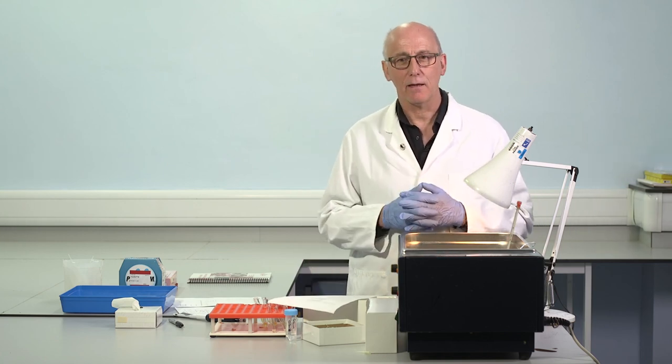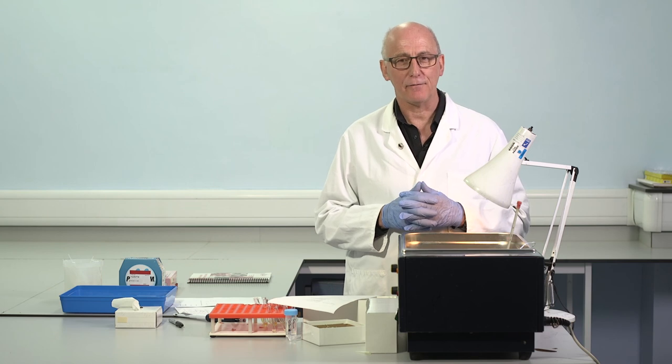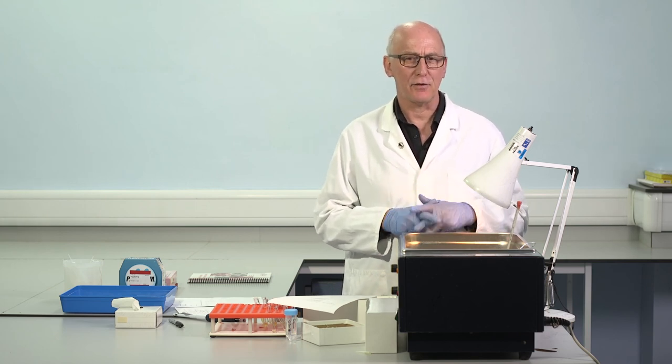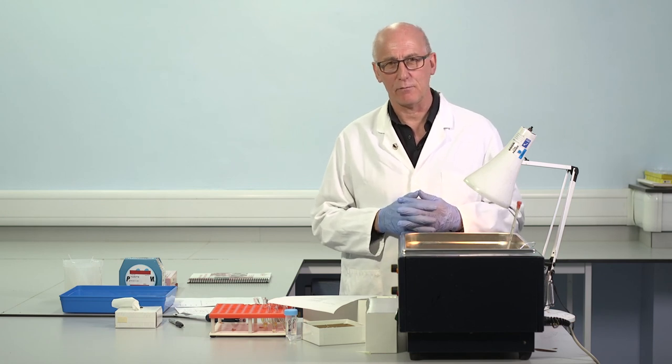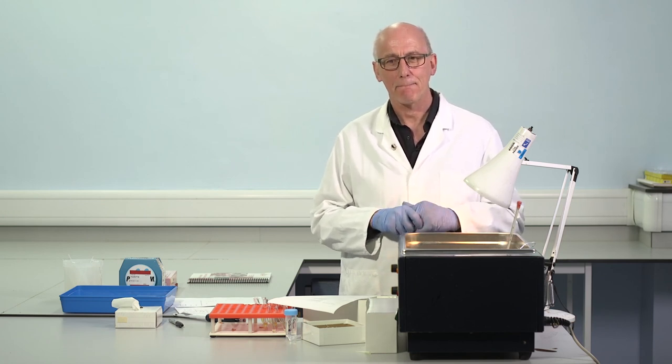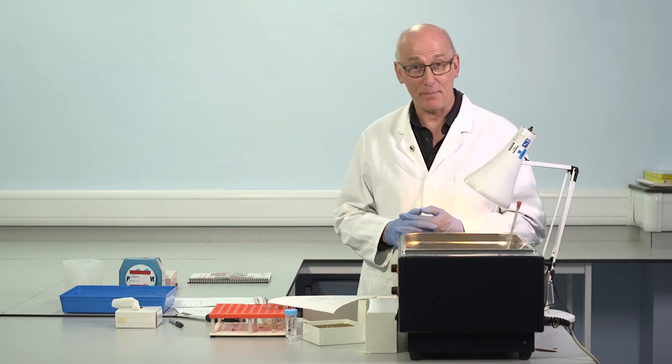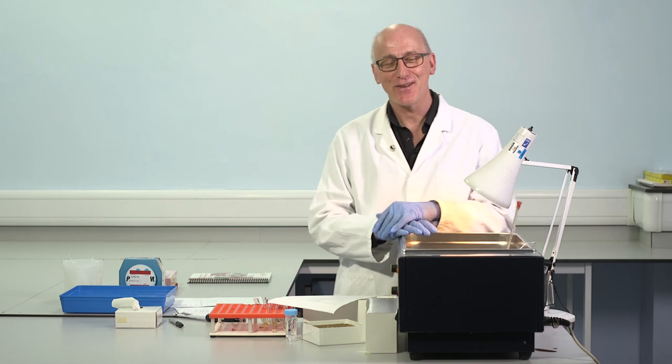We mentioned already prekallikrein deficiency, high molecular weight kininogen deficiency. We can also see differences between results with different reagents. So we've spent some considerable time discussing APTT. Thank you for your patience.